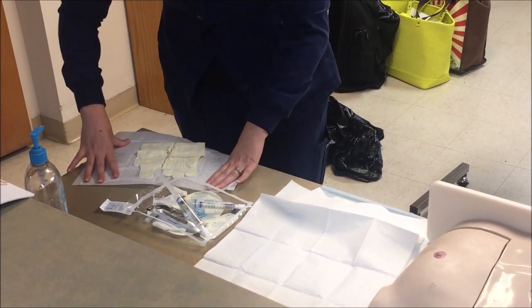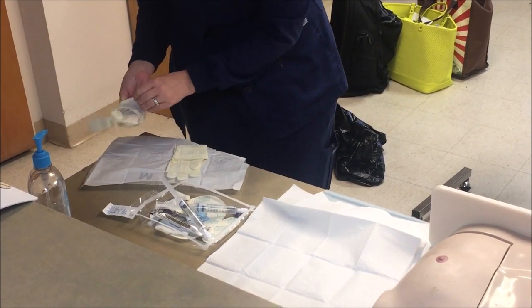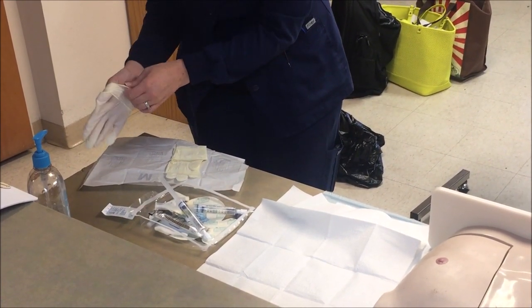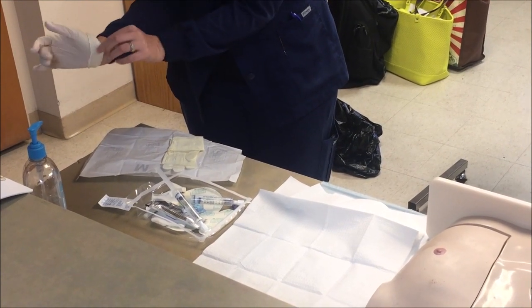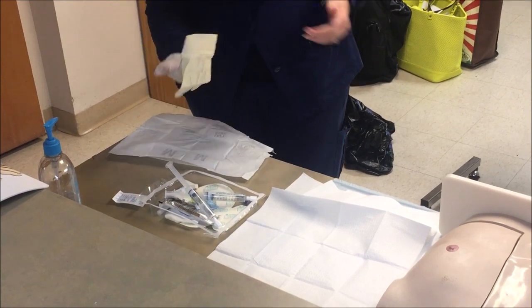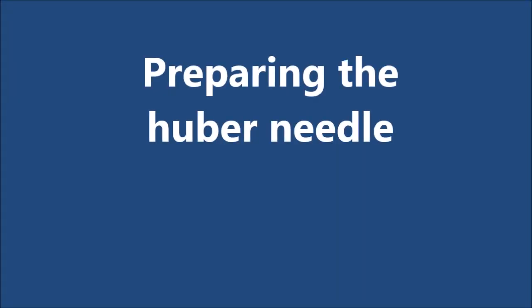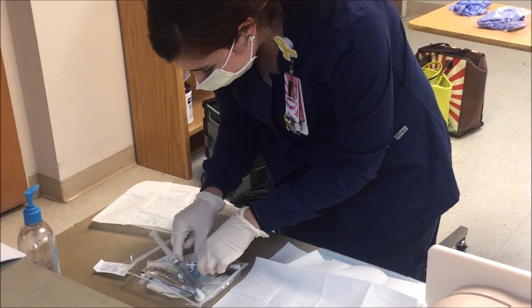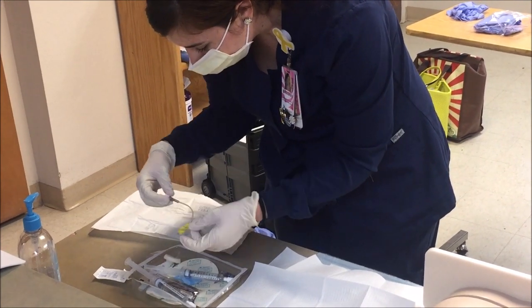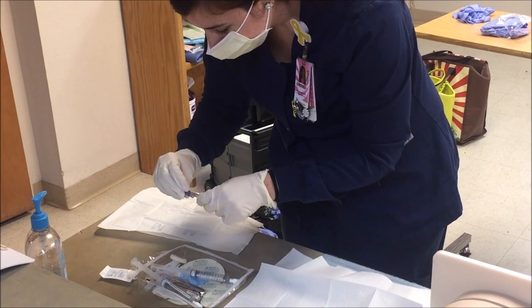Now it's time to don your sterile gloves using sterile technique. Now we are ready to prepare the Huber needle. Using sterile technique, you'll remove your Huber needle from your sterile field, remove the cap, and attach your injection cap.